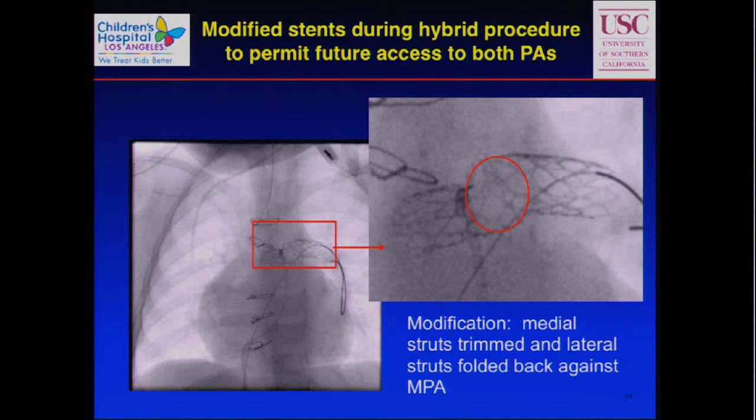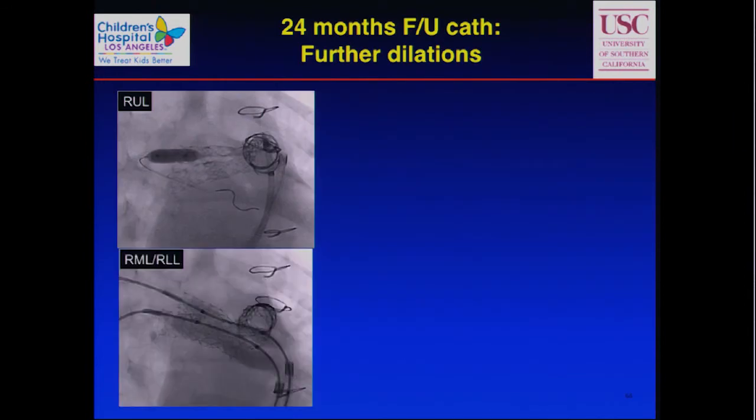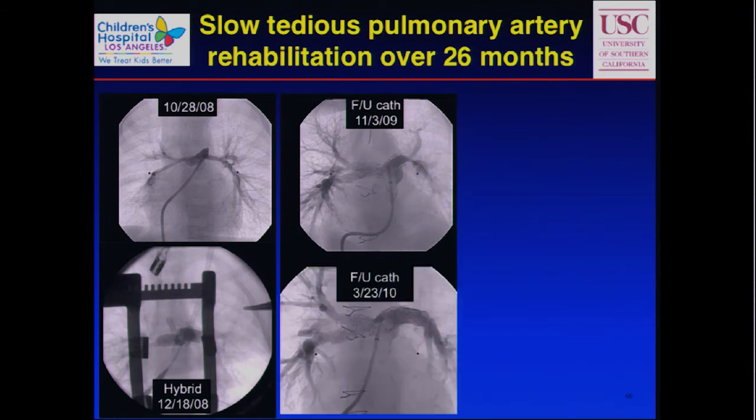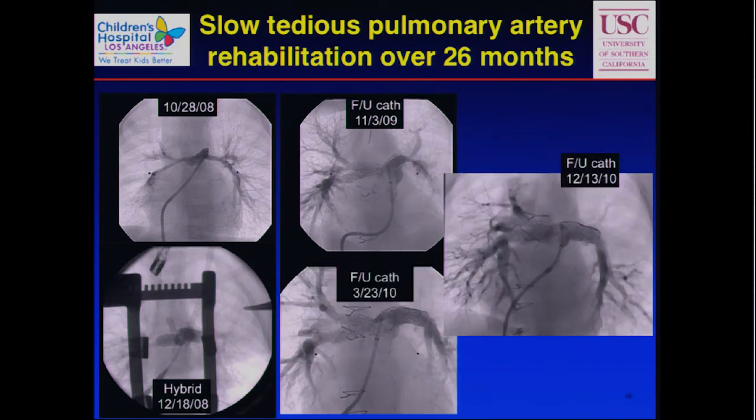The stents actually can be cut very easily. It's not very difficult. The surgical scissors are very good at this. So here we are further dilating everything, and this is what that looks like afterwards. I think we showed this earlier.